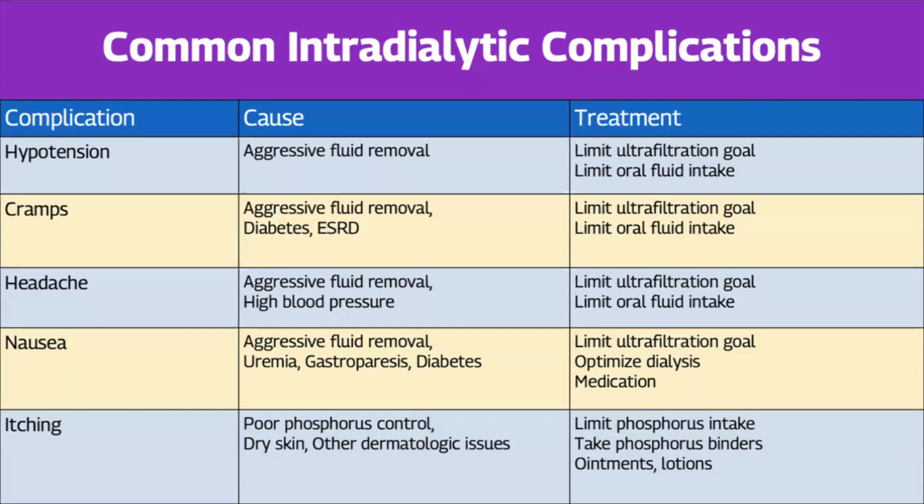This chart lists the most common events, their usual cause, and the potential treatment for them. The next set of slides: most facilities have standing orders for the nurse to follow to treat these complications. The next set of slides describes the experience and the care that inpatient and long-term care nurses might provide during the interdialytic period, which means between treatments.